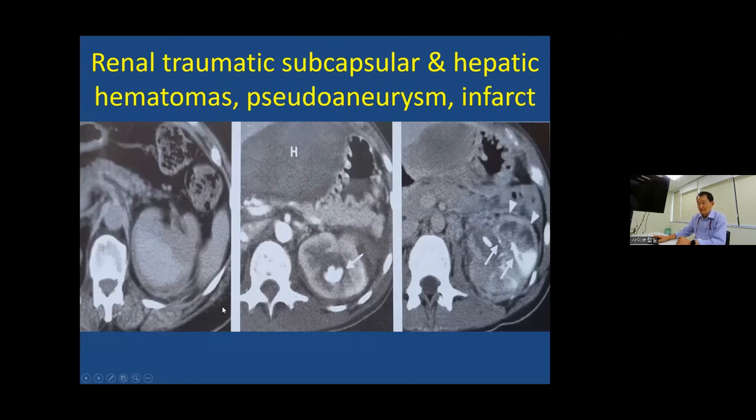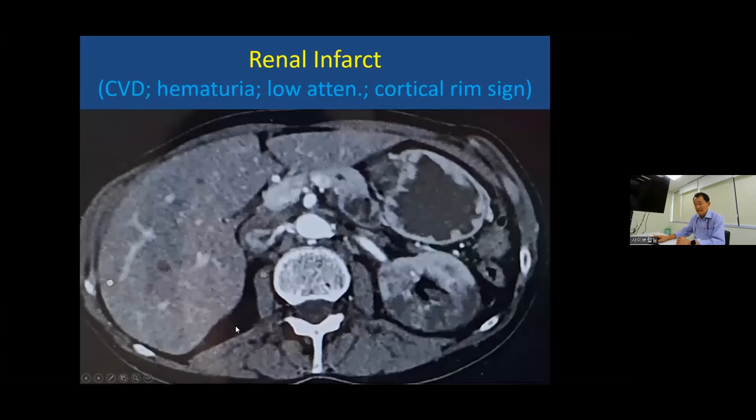Now, certainly hematoma, and subcapsular hematoma, on non-contrast shows high density, that's hemorrhage. Trauma will certainly cause this, and also leaking of contrast, so it's a trauma. Infarct is certainly shrunken, with some ill-defined cortex, because the vessels are blocked.